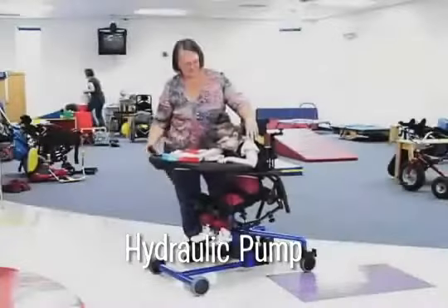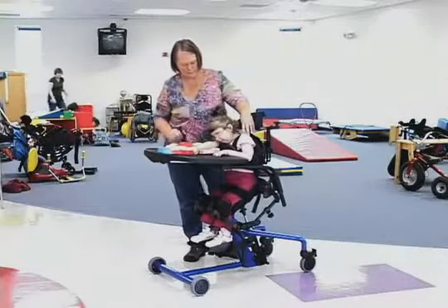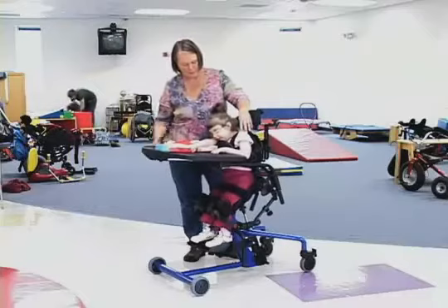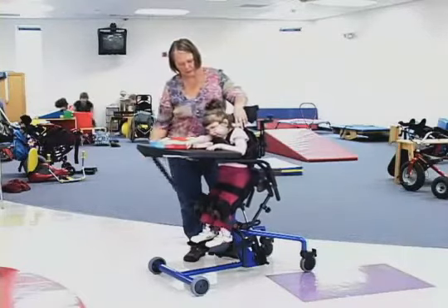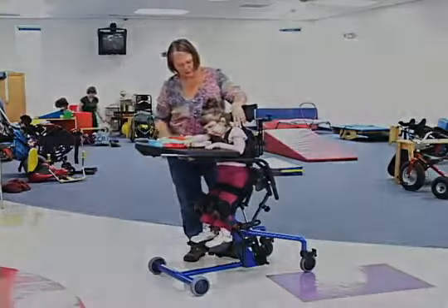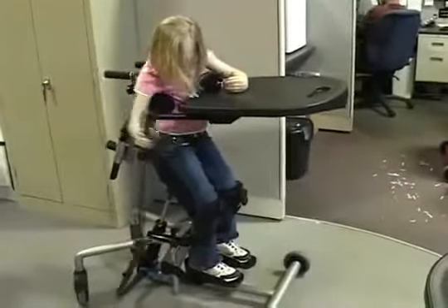The manual hydraulic pump has two distinct advantages over the standard gas spring lift. First, the caregiver can pump the child to standing in small, effortless increments. Second, if the child is able, they can independently pump up to standing and back down to sitting.